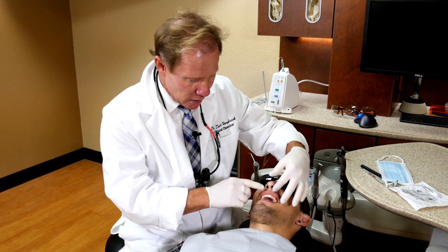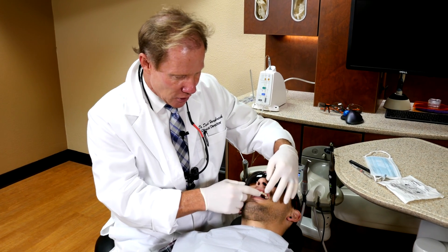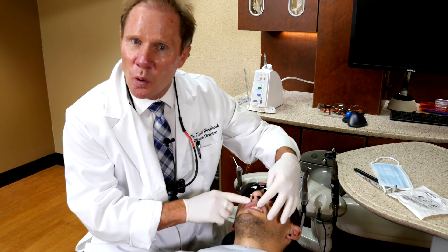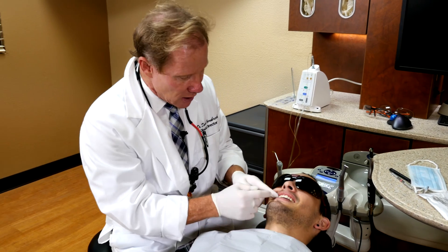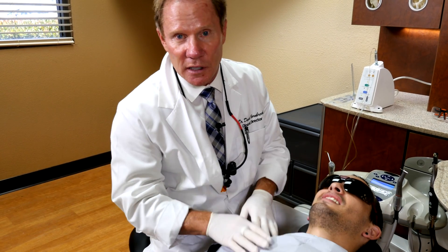We all know that if we were to do six, eight, or ten veneers, or even a single central, we numb the patient up in the buccal vestibule and then try it in. We ask the patient to smile and of course the lip is numb and can't move. I don't want lip anesthetic — I want lip mobility. Also, with multiple units, that's eight to ten different injection sites, and if you call patients the next night, they'll say the most uncomfortable part was the injection sites.